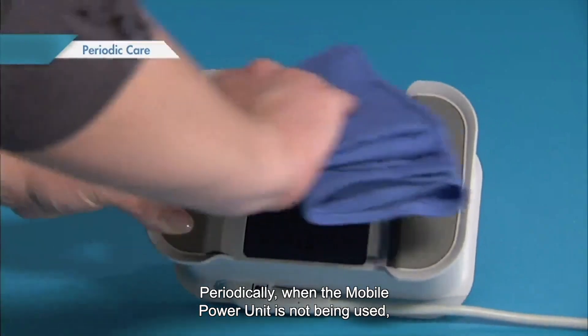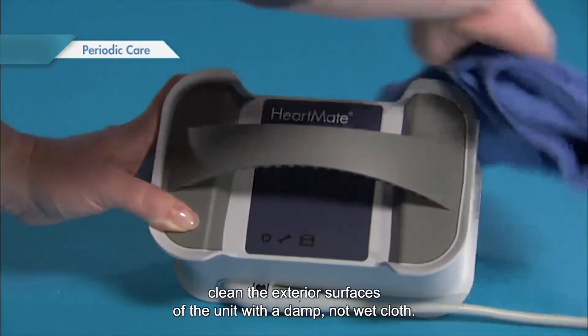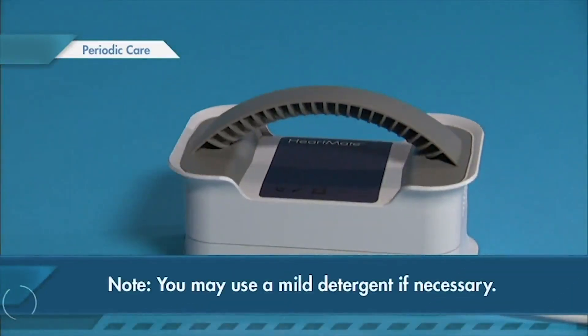Periodically, when the mobile power unit is not being used, clean the exterior surfaces of the unit with a damp, not wet cloth. You may use a mild detergent if necessary.